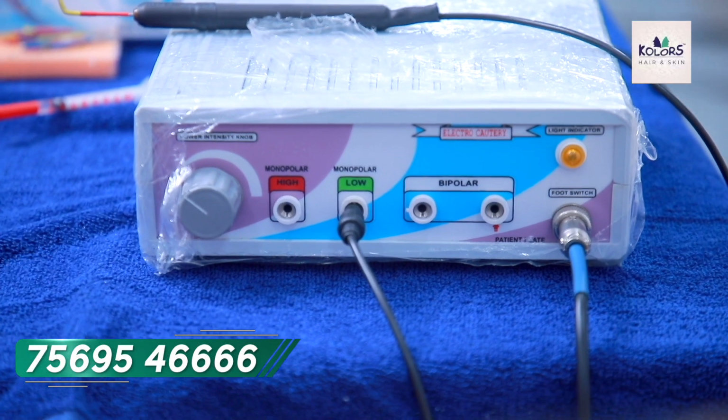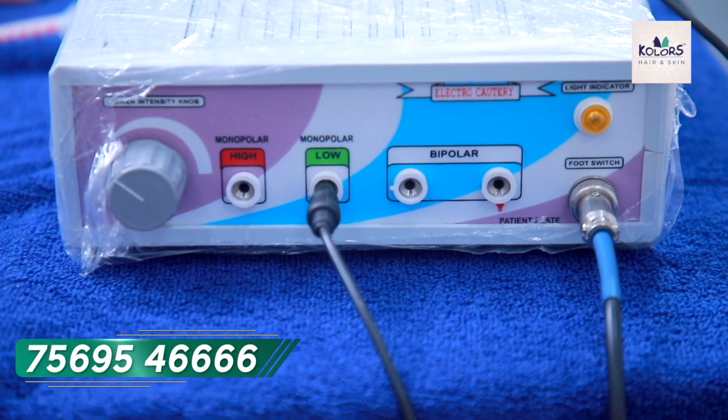Today I'll be speaking about the most common procedure done by almost every skin doctor in his own clinic, that is radiofrequency. So what is radiofrequency? It is a simple office procedure which uses radiofrequency waves at a frequency of 3.8 megahertz. What are the indications for which radiofrequency is done?